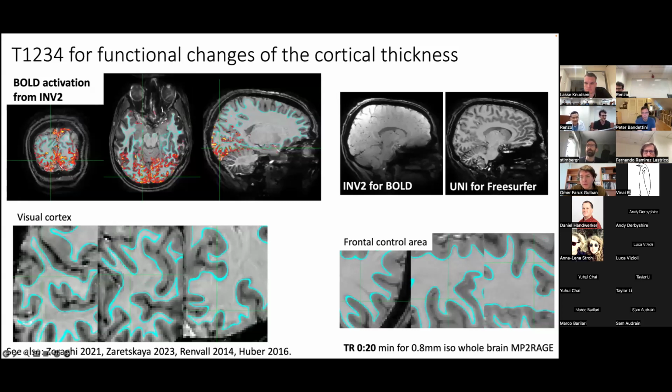I was going to make this point actually, and I think you might want to remove it because to fully discuss this aspect, I would have expected to see how much the numerical stability varies if you just repeat the same T1, T2, T3, T4 acquisition multiple times and push it the same way through FreeSurfer, because probably there is some variability due to small numerical changes in the input data.